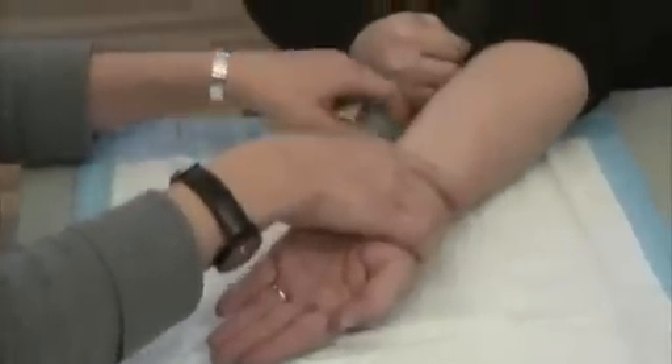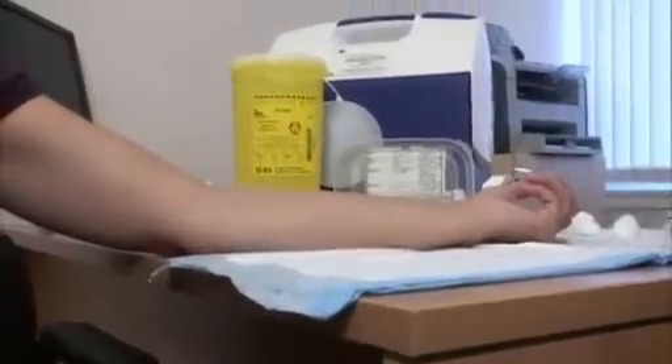On a firm surface, have the patient extend their left arm, palm side up, and slightly flexed at the elbow.